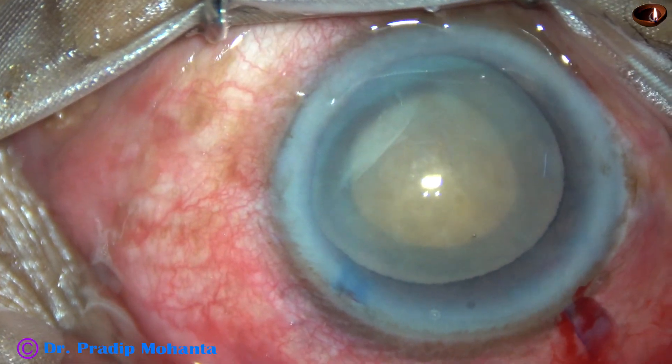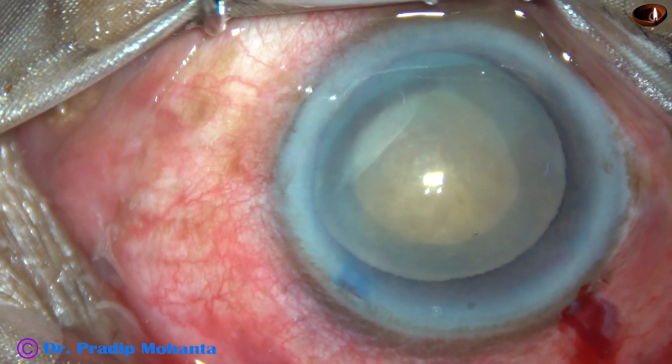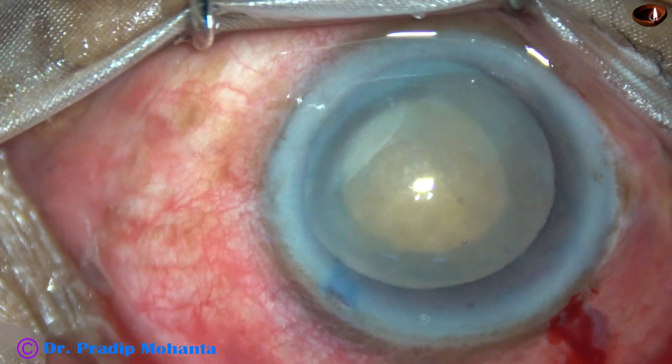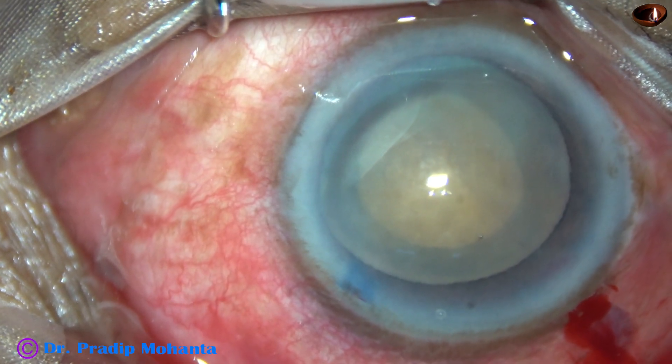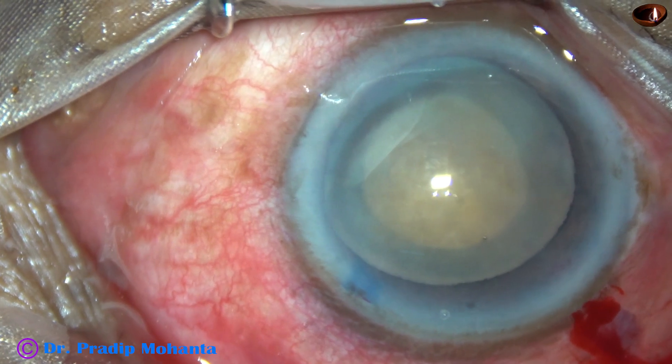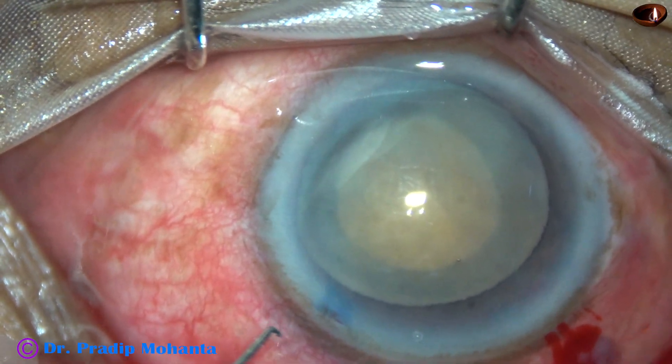If the rhexis is small, we can easily implant a CTR also if it is necessary. But in this case, it was not required. The zonule appears okay — it doesn't appear weak in this particular case.